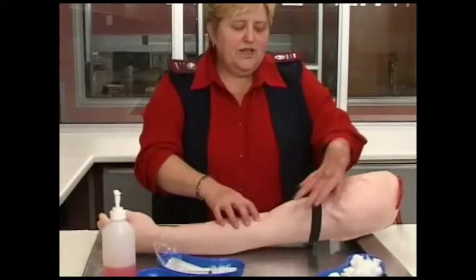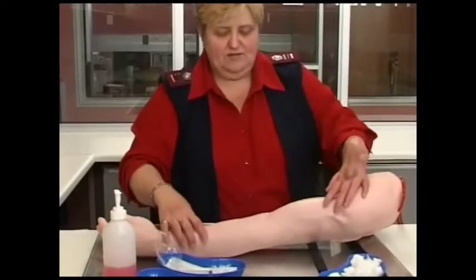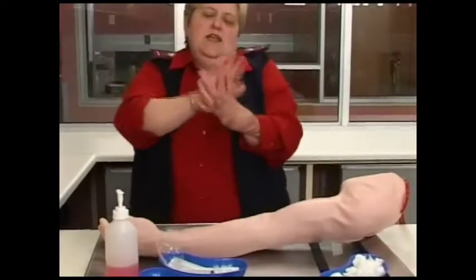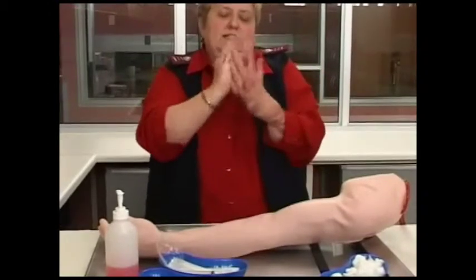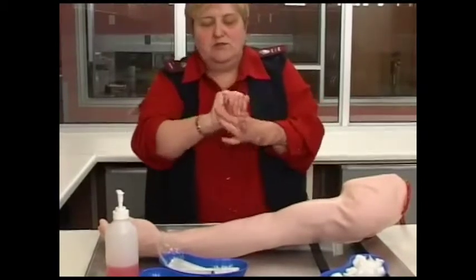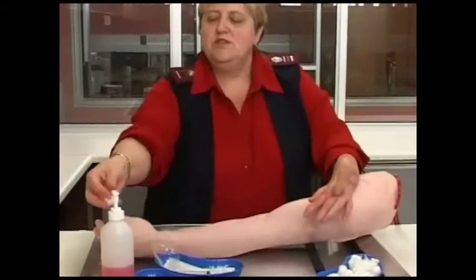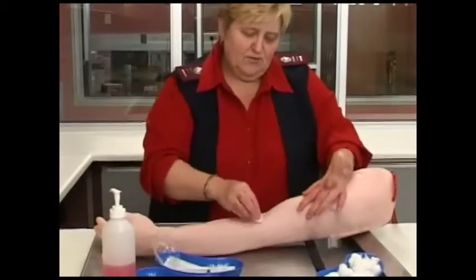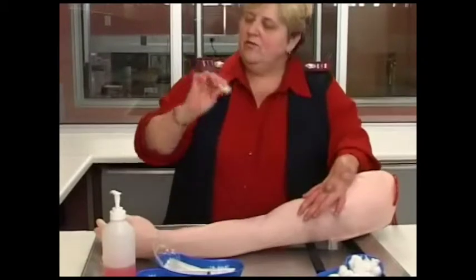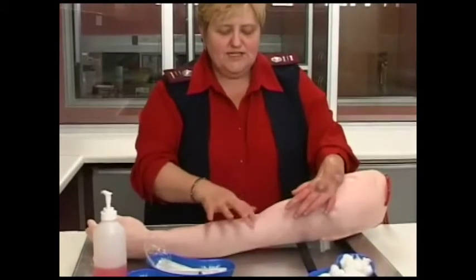After you have selected your vein, you loosen the tourniquet and clean that area. You are going to wash your hands, use an alcohol swab, and put on gloves. Take your cotton wool ball and clean the site in a circular movement, then throw it in your waste bin. Now you need to wait for this area to dry.